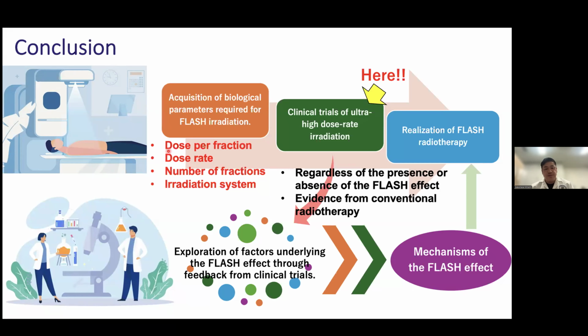The acquisition of key treatment parameters such as dose rate, dose, and temporal structure of radiation is already nearing completion in many countries.